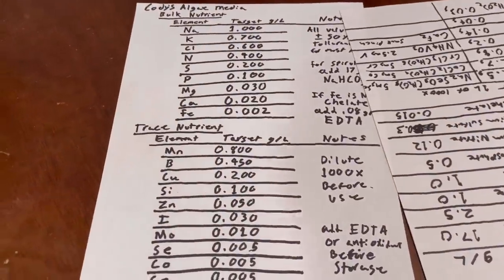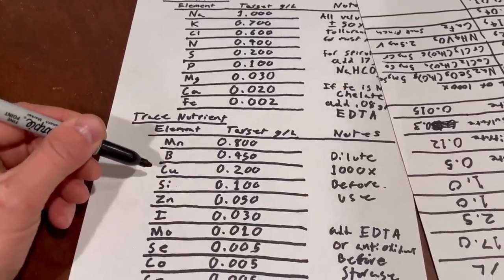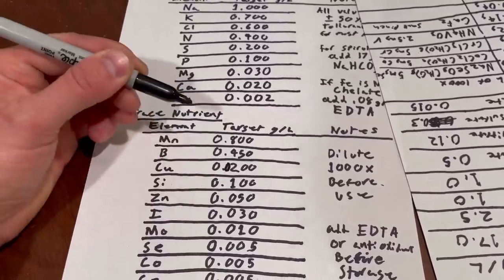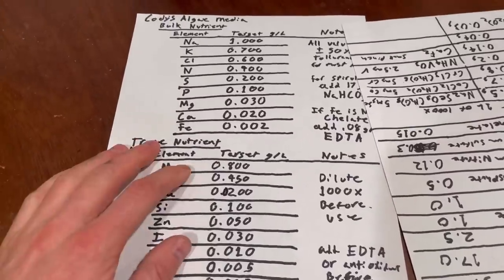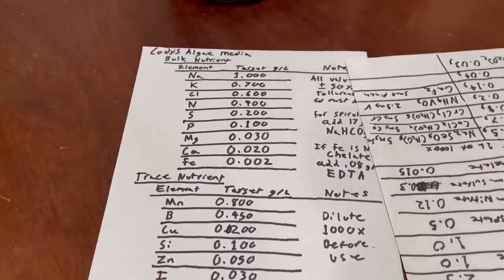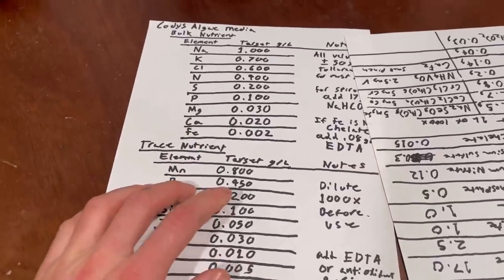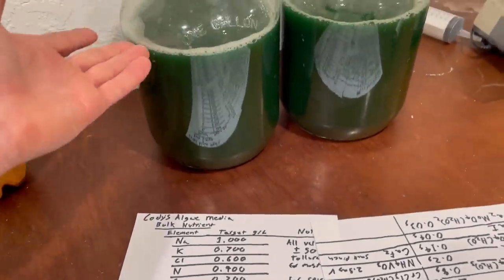First, several people mentioned there was a lot of copper in my mix. I went and looked and yeah, there should have been a zero there — I must have copied it down wrong — because I ended up with 10 times the amount of copper. I had it right on this solution here, but for whatever reason ended up with way too much copper.